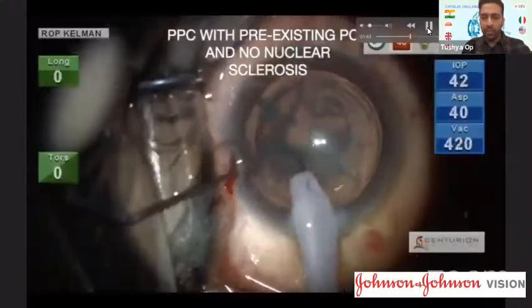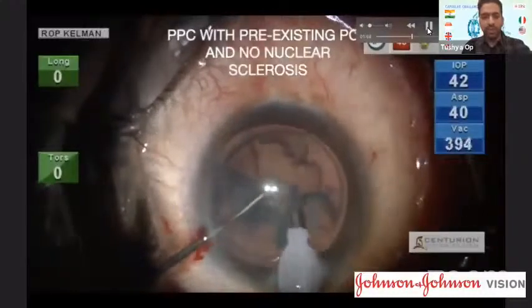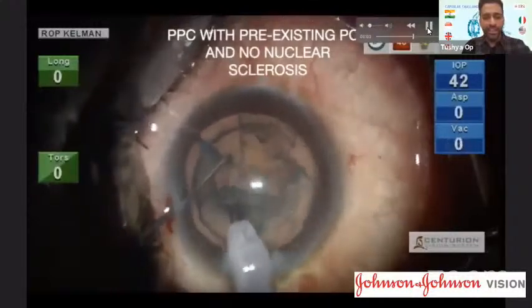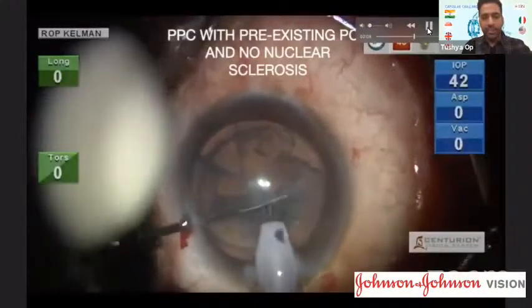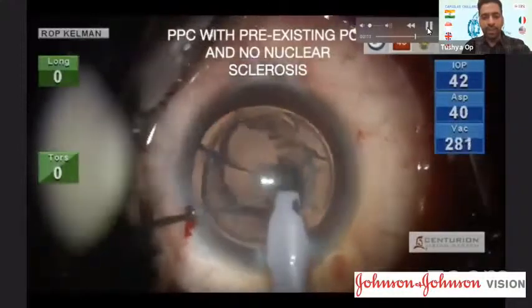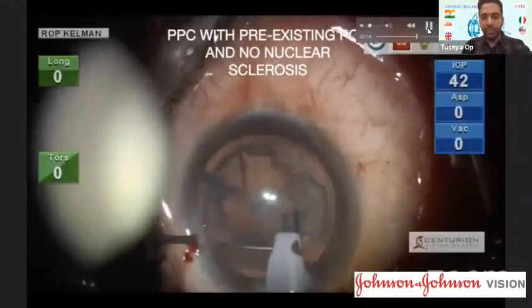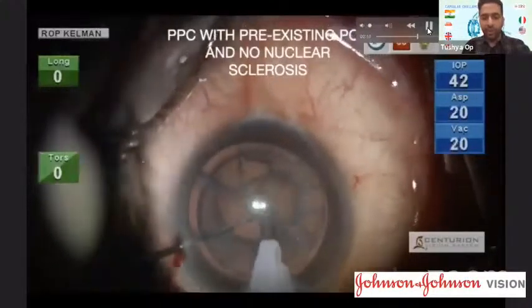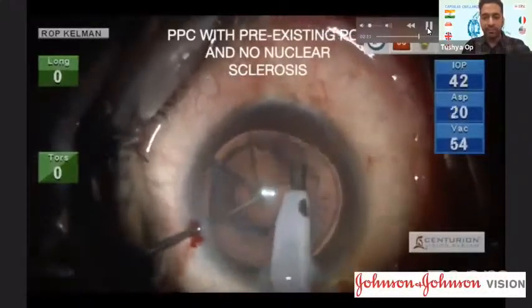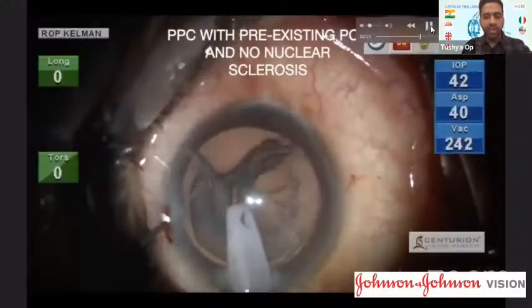Slow motion phaco emulsification was followed. Safe phaco emulsification techniques with low IOP. At no point was the nucleus rotated. As the layers were aspirated by the phaco probe, the outer corticonuclear layer provided a shield to the PCR. With the aid of the chopper, the outer nuclear layer was dislodged and aspirated. It was made sure that the capsular bag was not overinflated at any point of time.